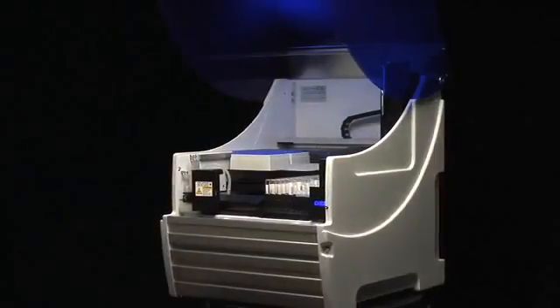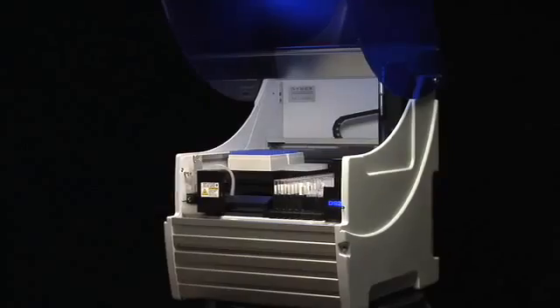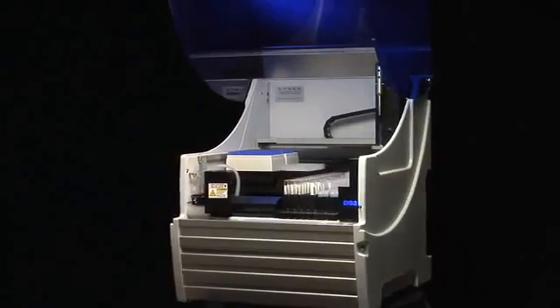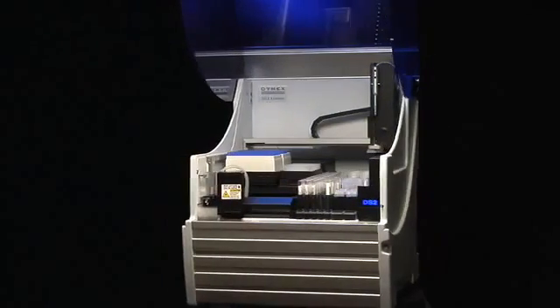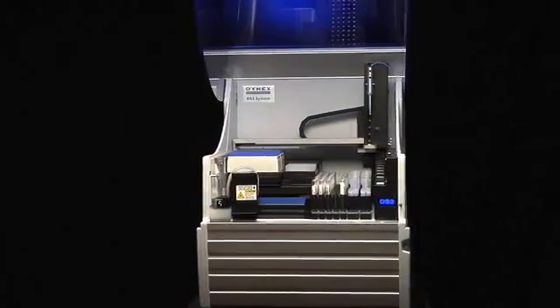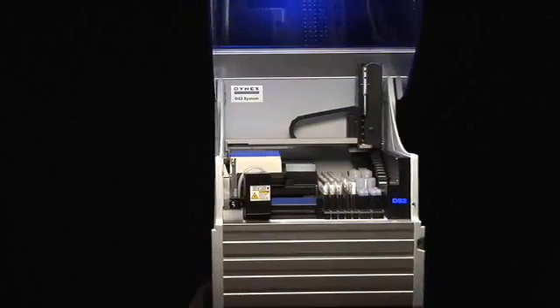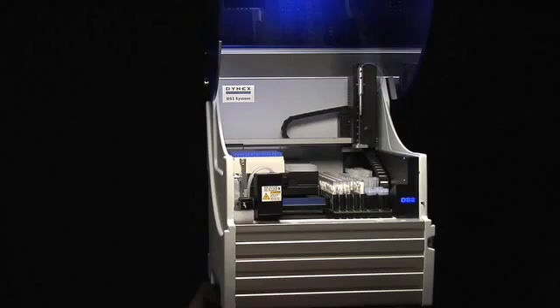An easy step up to automation. The DS2 by Dynex Technologies, a Magellan Biosciences company, improving outcomes from discovery to diagnostics.